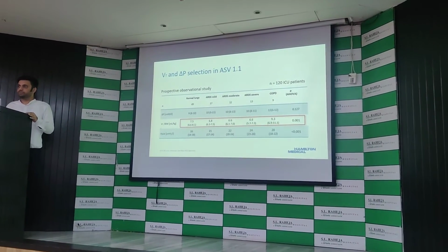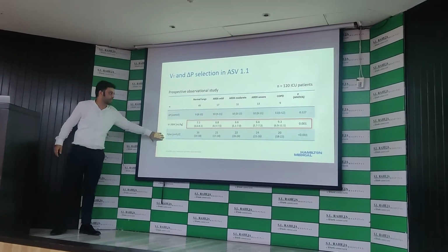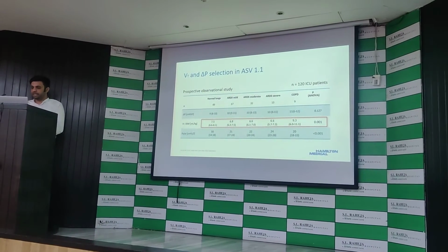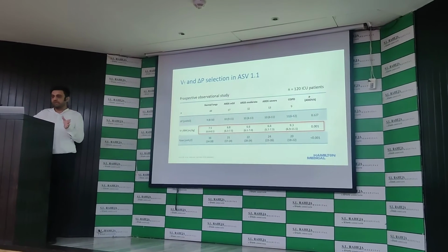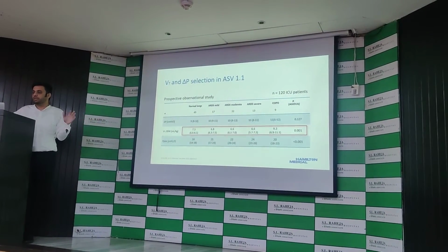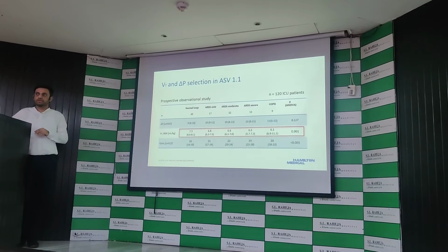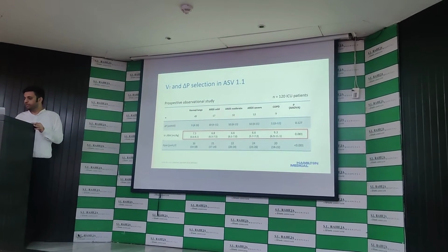So it maintained the plateau pressure and it maintained the driving pressure here, as mentioned in the study. So ultimately, what exactly we say here is that ASV is able to select lung protective ventilation with limited driving pressures in the passive patient in the intensive care unit, as per the different lung conditions of the patient. So this was a study done and proven, which talked about the change in the volume and the pressure.